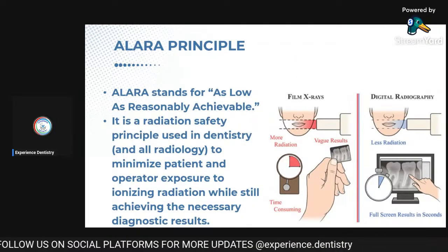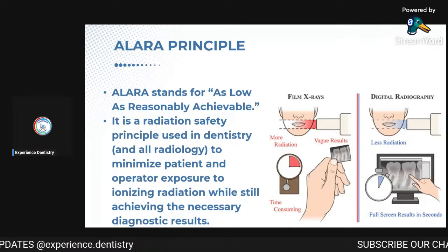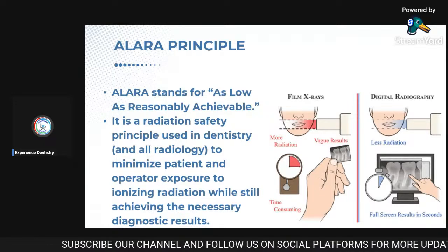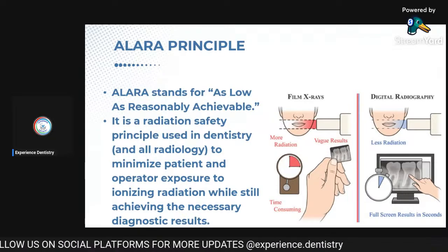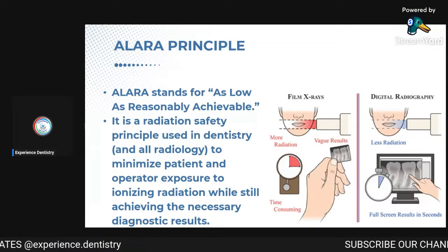So in this picture, you can analyze a little bit more. ALARA stands for as low as reasonably achievable. It is a radiation safety principle used in dentistry and all radiology to minimize patient and operator exposure to ionizing radiation while still achieving the necessary diagnostic results. Okay, so you have to protect yourself and your patient from the harmful ionizing radiation.